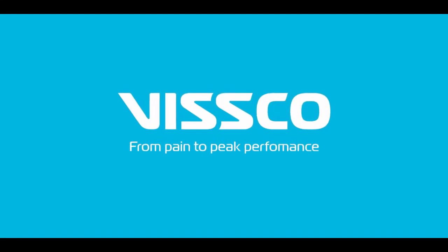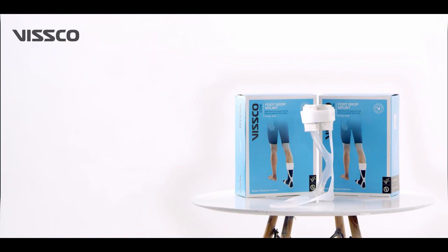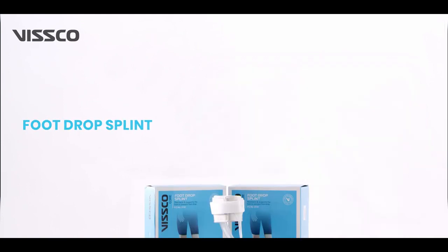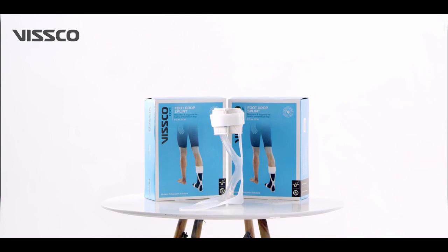Hi there, greetings from Vissco. In this video, let us learn a little about a foot drop splint, product code 0730, and how to wear it correctly.